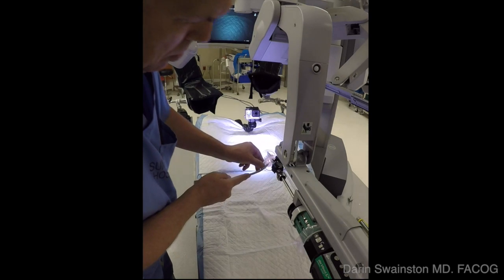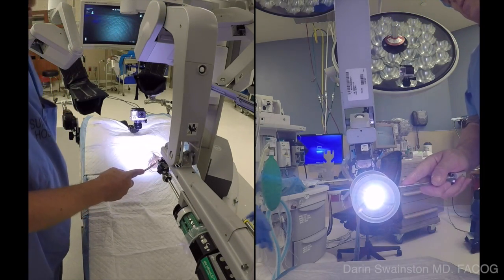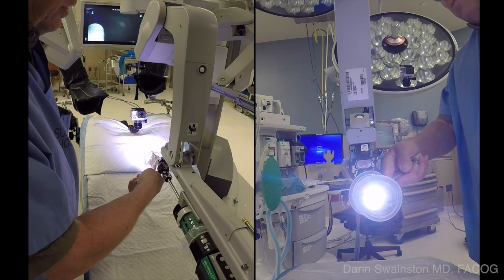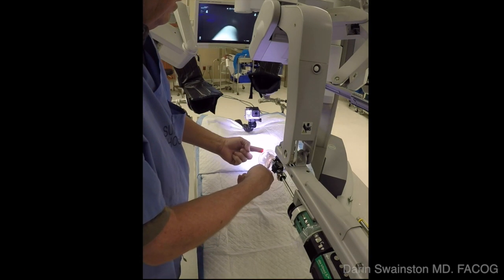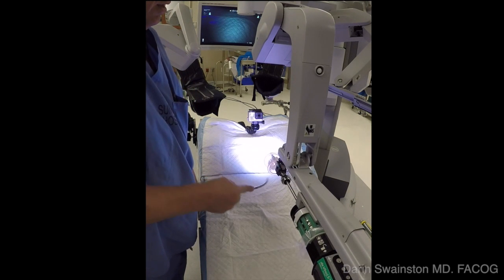The finger is placed on the back of the curve. The 30-degree scope is pointed toward the target organ. The trocar is placed to the level of the first V. It is then pivoted medially and rotated clockwise. When you do this, it always comes immediately into view right underneath the 30-degree scope.